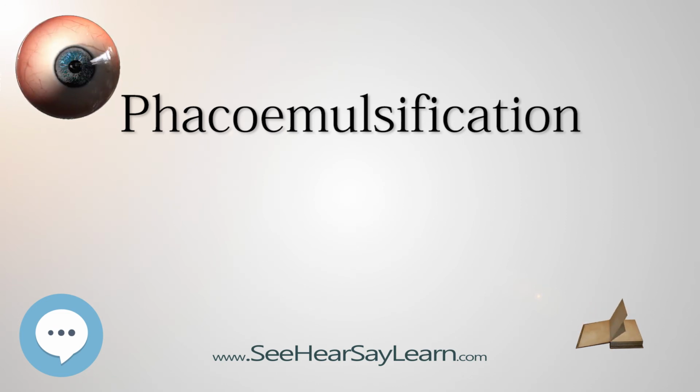History. Charles Kellman introduced phacoemulsification in 1967 after being inspired by his dentist's ultrasonic probe. Research. A Cochrane review seeking to determine whether glaucoma surgery combined with cataract surgery via phacoemulsification has any advantages over cataract surgery via phacoemulsification, alone found that eyes that underwent combined glaucoma and phacoemulsification surgery had a significantly lower intraocular pressure, -1.62 mmHg, compared to eyes that underwent phacoemulsification cataract surgery alone.